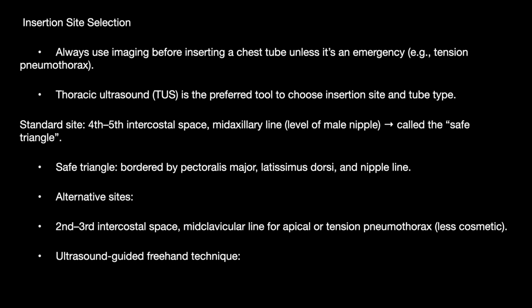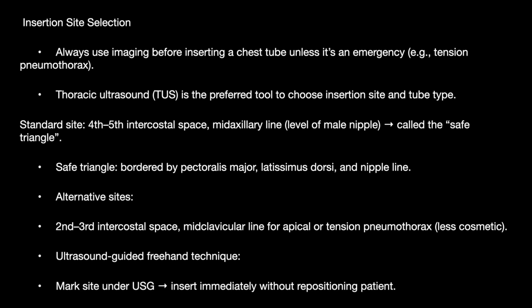Ultrasound guided freehand technique can be used. That is, you check the ultrasound and put it wherever you feel is the best. Mark the site under the ultrasound and then put it. So there are no such restrictions on the site of the rib space.